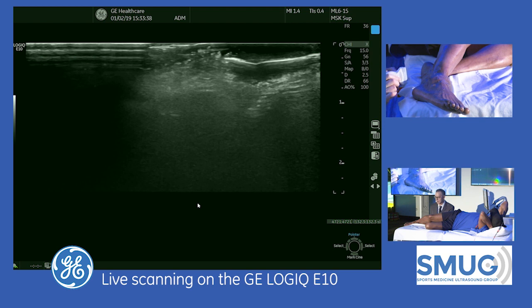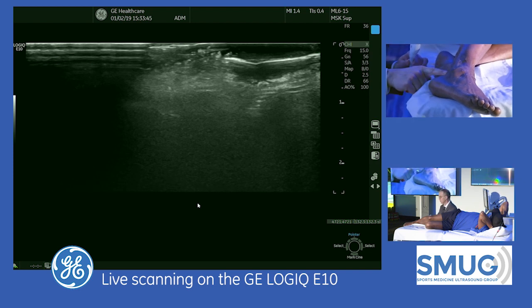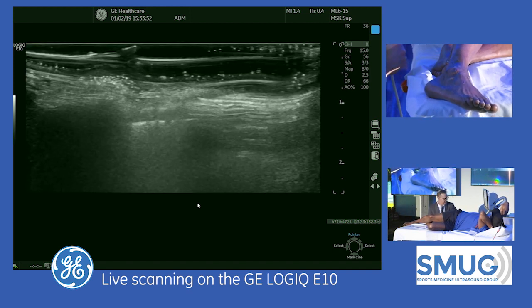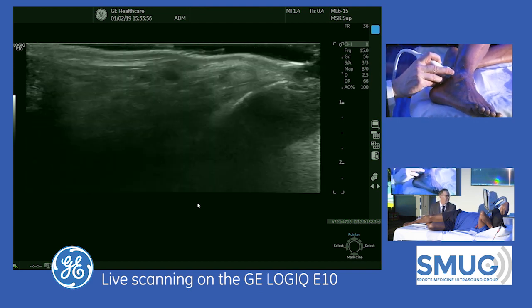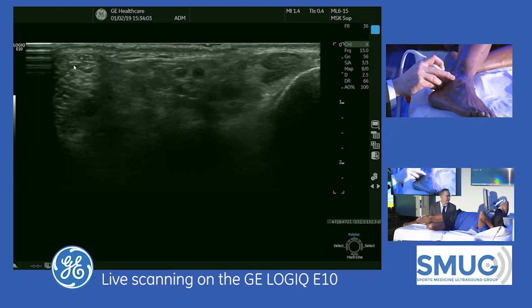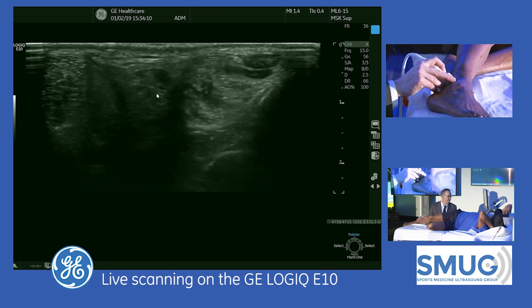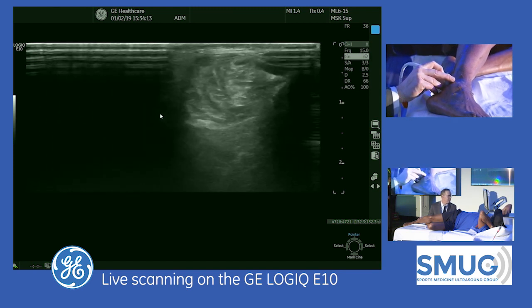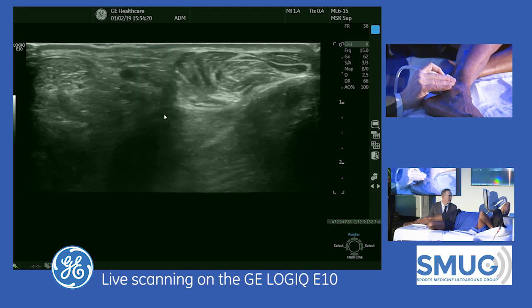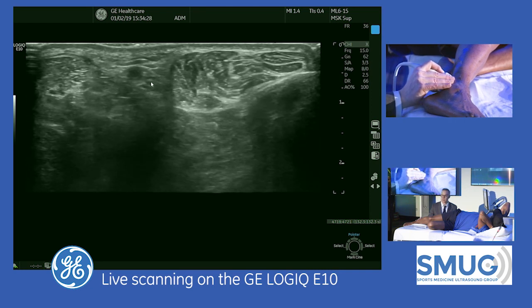Let's look at the sural nerve since the lateral ankle's here. This is the fibula and here's the Achilles — the sural nerve will be right between the two. I'm going to put the transducer between the Achilles and the peroneal tendons right at the level of the fibula. On the right we see the peroneal tendons, here's the Achilles. In the middle of this fat pad, right in the center, we're going to see the sural nerve, with the lesser saphenous vein right next to it.